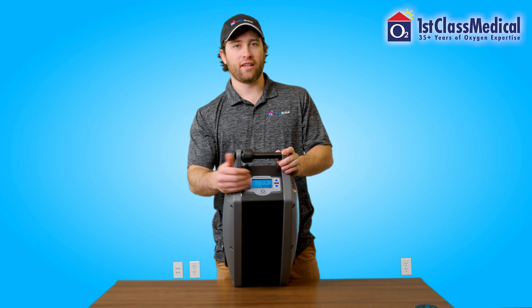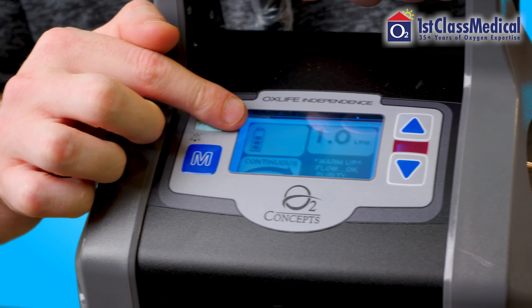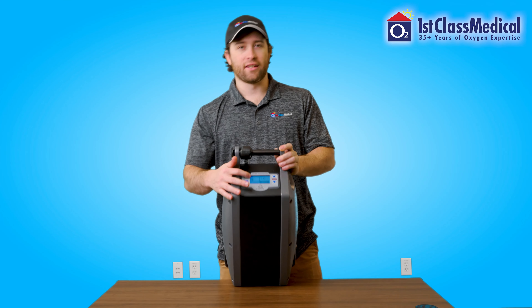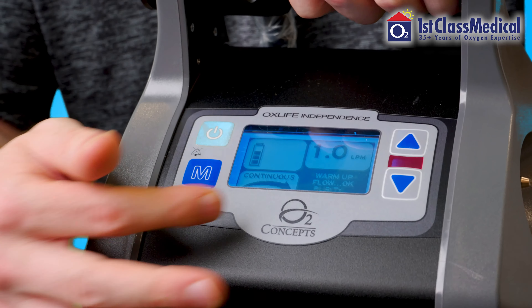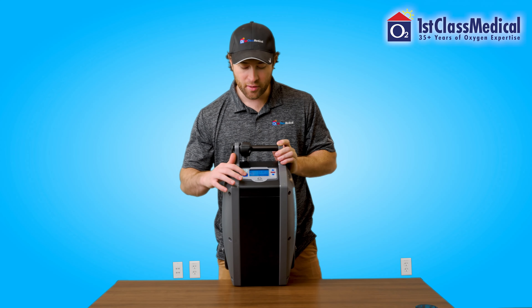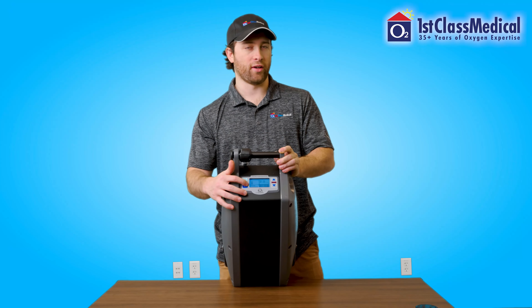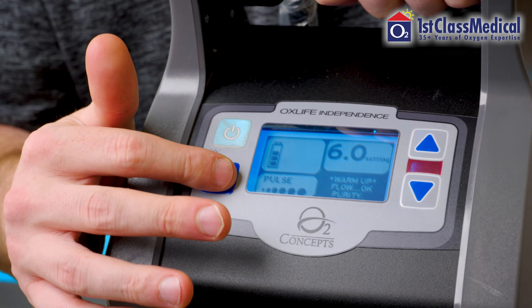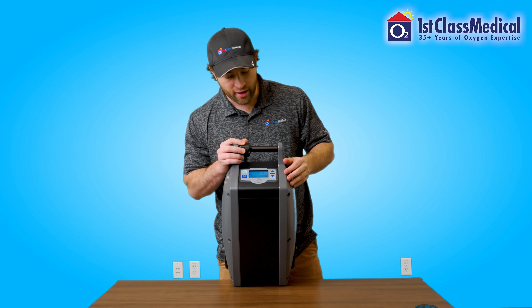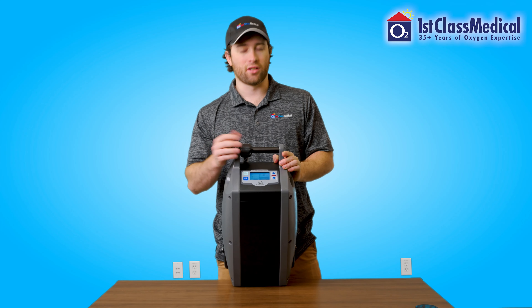You're going to see a few different things on this screen. On the top, of course, your battery life — you're going to have different notches that will let you know how full the battery is. In this case, we're looking at 75%. The flow rate the unit is on — currently it's on continuous flow. By just pressing the M button, you'll see that we switched to pulse flow. On the bottom, it shows warm-up, flow, and purity status as the unit warms up.